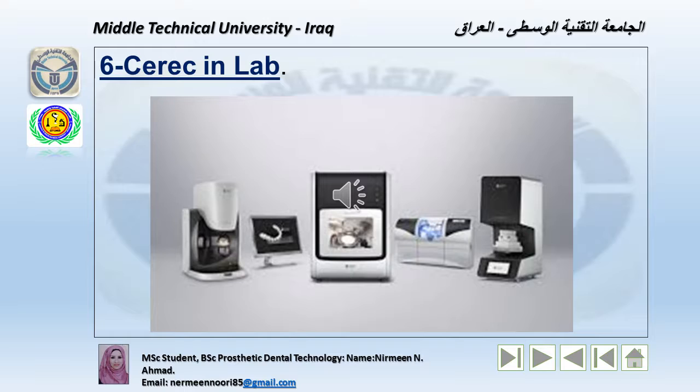The laboratory technician inserts the appropriate Vita block into the Cerec Lab machine for milling. The process center is a dental lab, with a laser scanning machine, custom design CAD program with a database, and fully automatic CAM process.